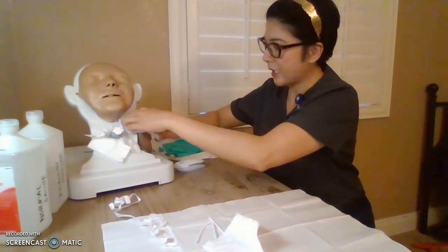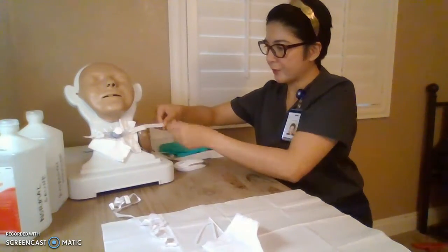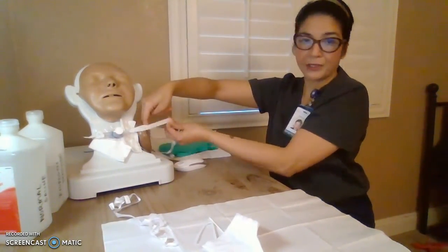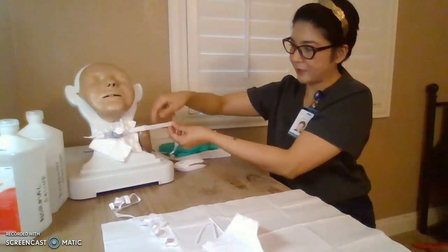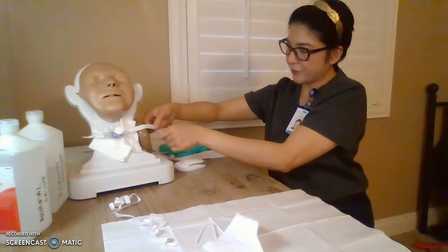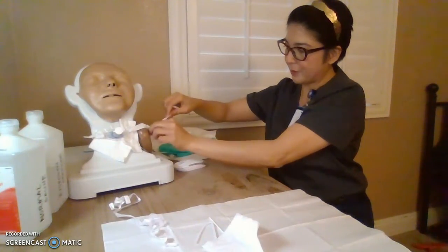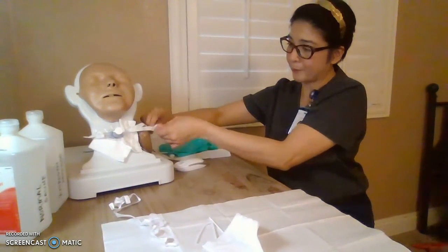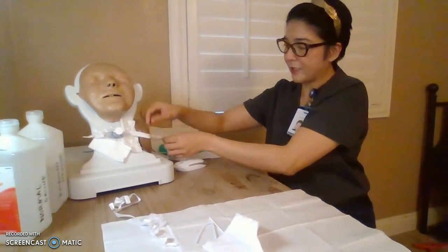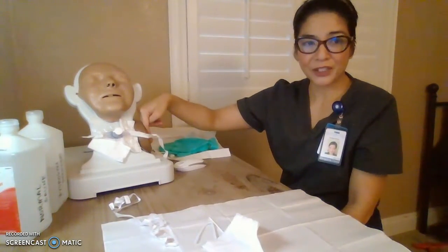See, okay. So how do we know the tightness? How do we gauge the tightness? Make sure we can insert 2 fingers in between, okay? The patient's skin and the tie. All right, and now you're going to do a double knot. Okay, after you do a double knot, you can put a 4x4 gauze in between that and then tape it. Make sure that it does it for patient safety, to prevent any skin injuries. Okay, so 2 fingers right there. That's just how it's supposed to be. All right, so making sure it's not too tight.